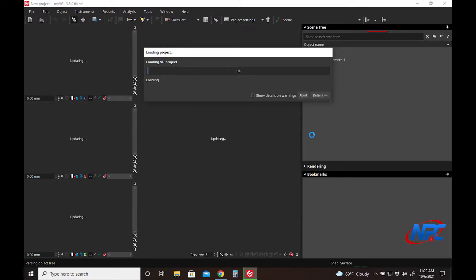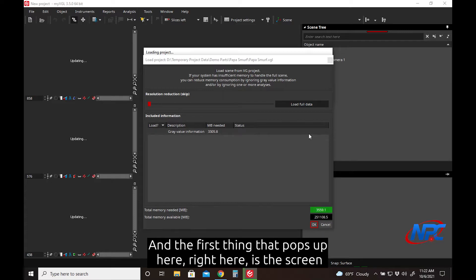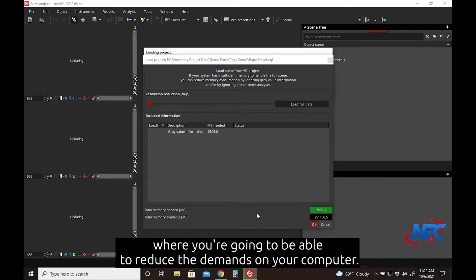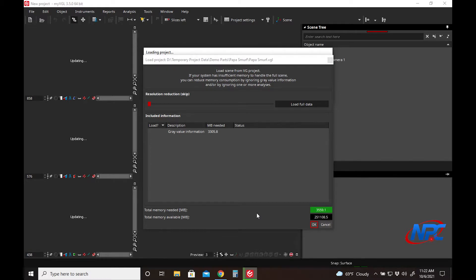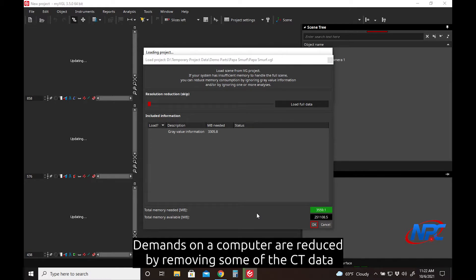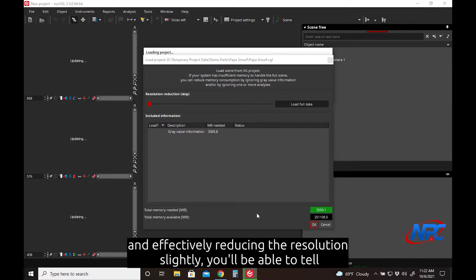Open Project, and the first screen that pops up here is the screen where you're going to be able to reduce the demands on your computer. Demands on your computer are reduced by removing some of the CT data and effectively reducing the resolution slightly.